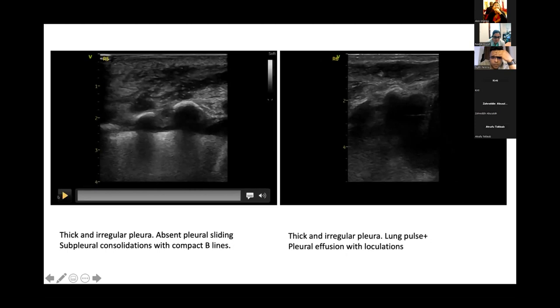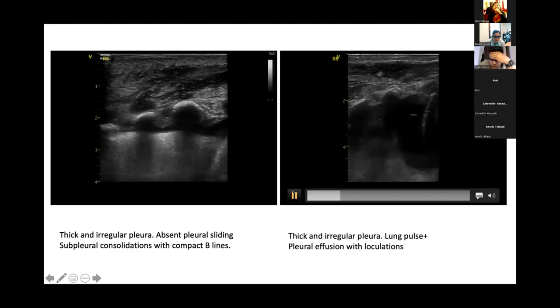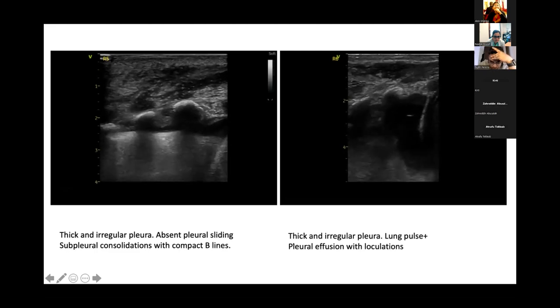So there is some respiratory improvement clinically, but I have to say the lung pictures haven't changed very much. That's interesting, because they often precede the clinical improvement, or at least they go hand in hand with the clinical improvement. This is one of the uses of lung scoring in adult medicine, to see how patients improve or don't improve on antibiotics when they acquire ventilator-associated pneumonia.